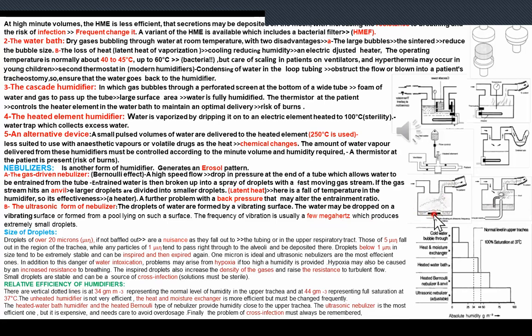This speed is capable of inducing very fine particles of humidification to the patient. Of course, you must take care, because too much humidification will induce, as we said before, what we call aspiration pneumonitis. And the drawback of it, of course, is that it is relatively expensive, but it's the most efficient vaporizer.